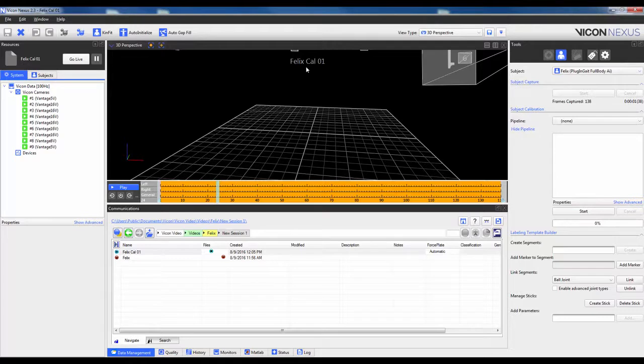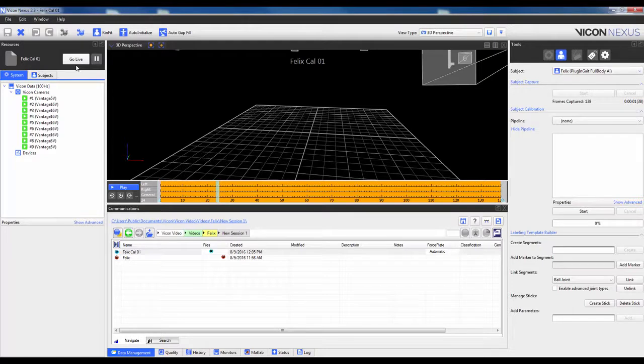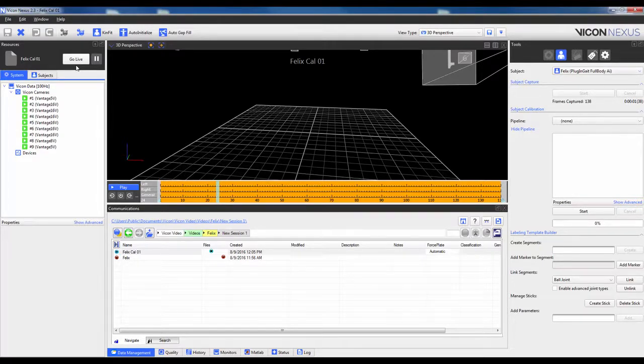You can process the Static Trial now or immediately begin capturing Dynamic Trials by clicking Go Live. If you wait to process the Static Trial, there is a good chance that the real-time labeling will not be reliable. As such, I will show you the workflow for processing the Static Trial before capturing any Dynamic Trials.